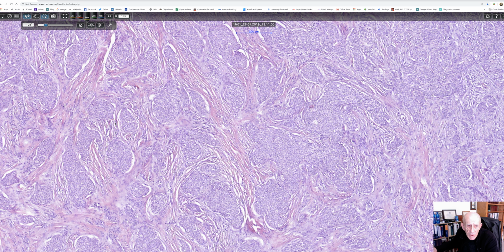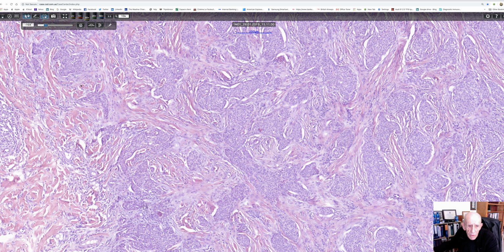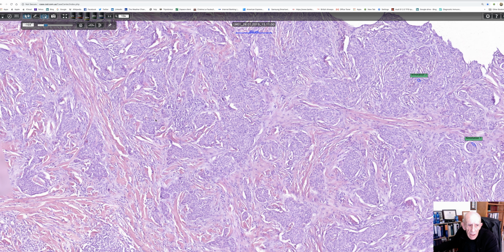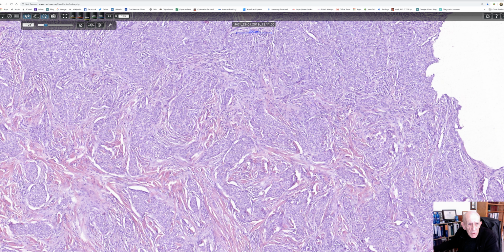Although sometimes you may confuse this with, say, a well-differentiated non-keratinizing squame, the important thing to remember is porocarcinoma has a metastasis rate that can kill you.